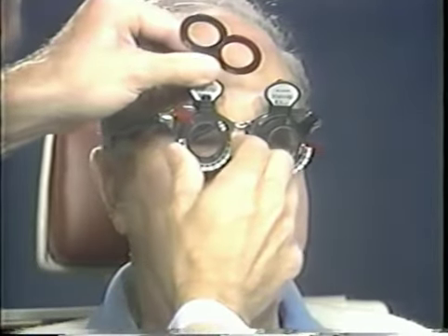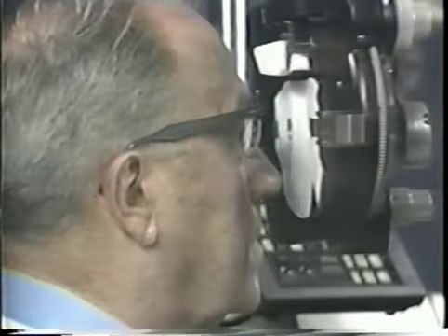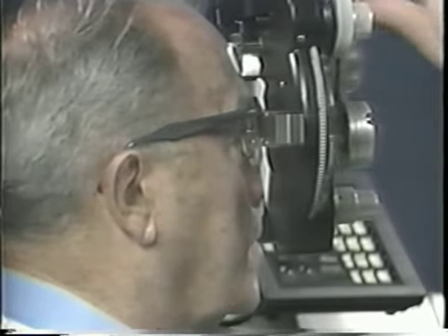A more convenient and more accurate way of controlling vertex distance during the refraction is to refract over the patient's old glasses. This can be done with loose lenses in trial lens clips, or can be done behind a phoropter, being careful that the patient does not change the vertex distance by pressing hard against the phoropter.